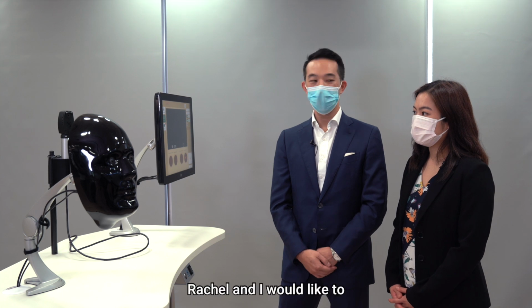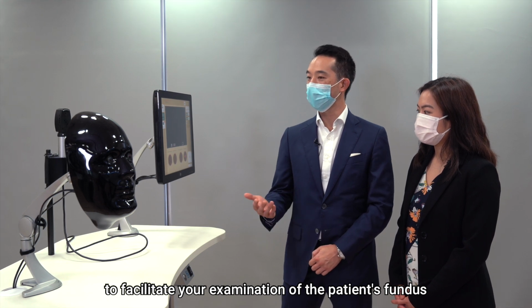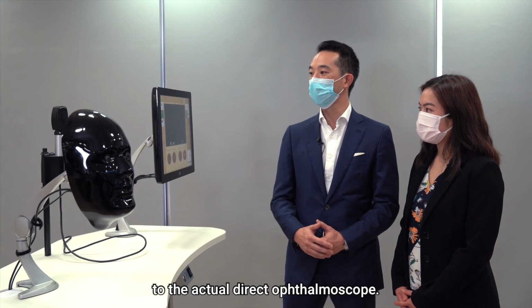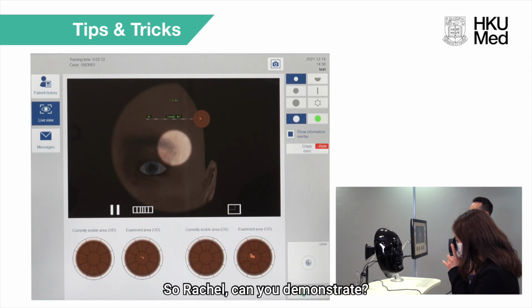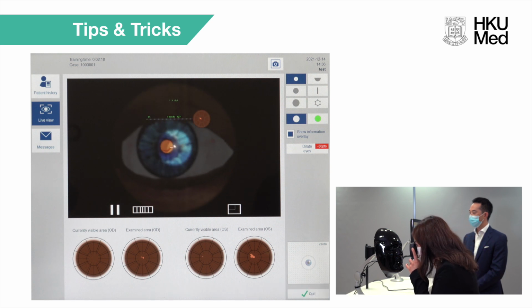So for this part, Rachel and I would like to offer you some tips and tricks to facilitate your examination of the patient's fundus through not only the virtual scope, but also applying this technique to the actual direct ophthalmoscope. So Rachel, can you demonstrate? So now I'll try to find the optic disc first.